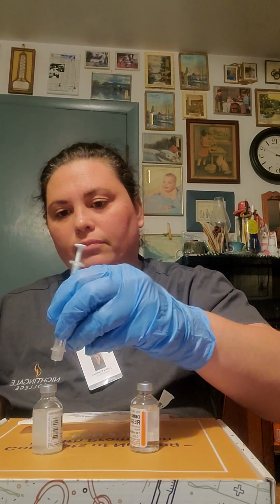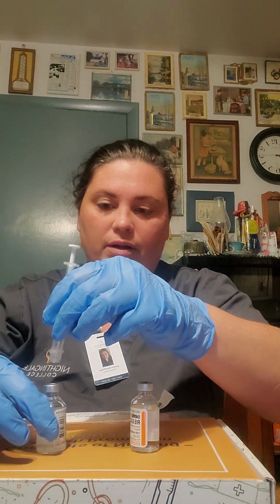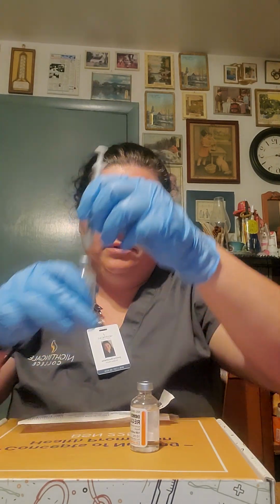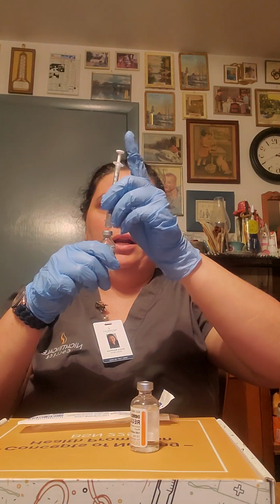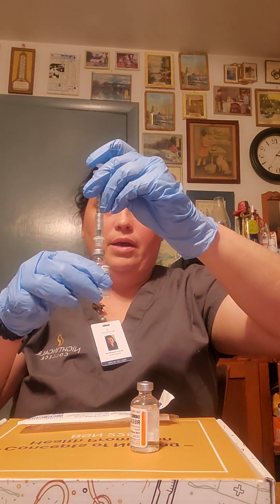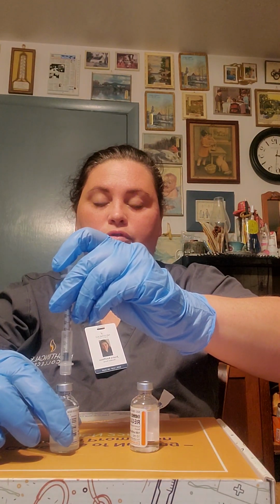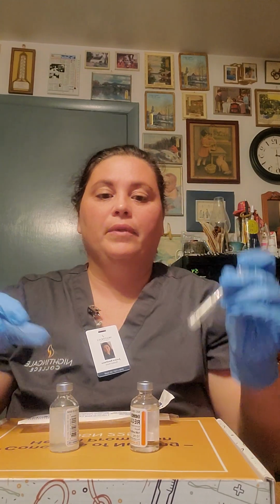Okay, I'm going to inject this into my NPH. Going to go straight down in, making sure that my needle isn't touching the medication and I'm not drawing up anything with it. Okay, I'm going to pull straight out.